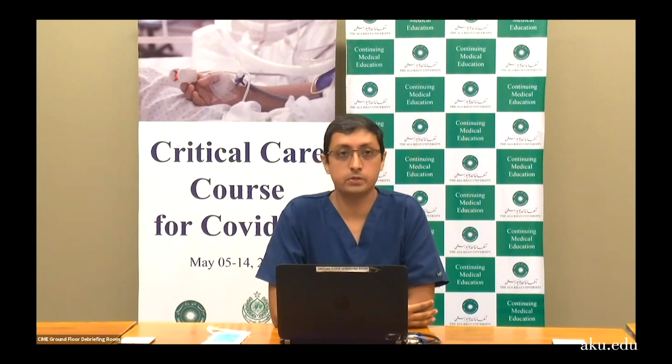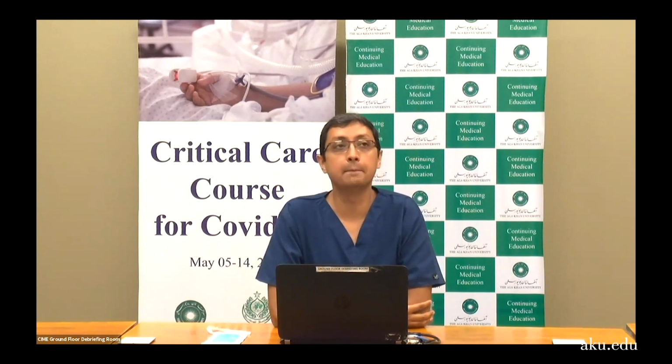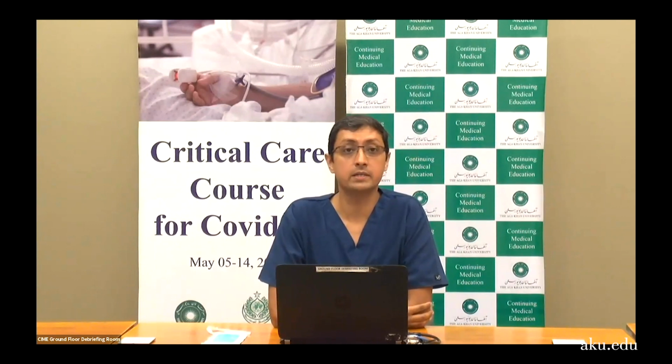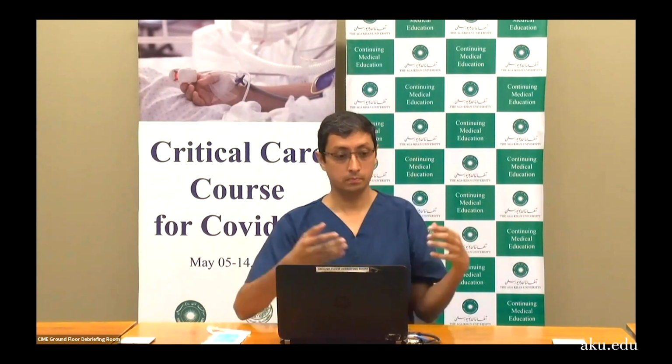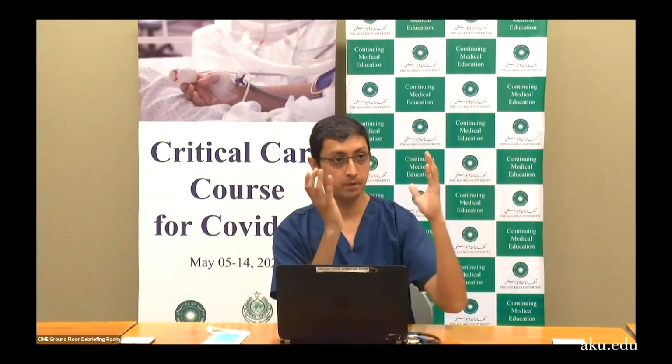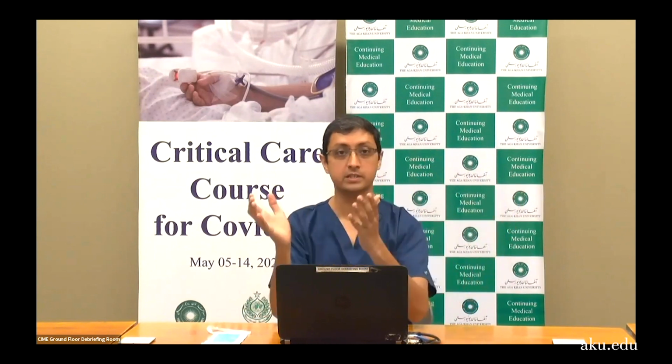There are a lot of videos on social media for ventilating multiple patients, but look at it this way. All societies have not recommended it. The reason is that each patient has their own compliance, their own problems. Two balloons are never alike, so we cannot expect two patients to be alike.